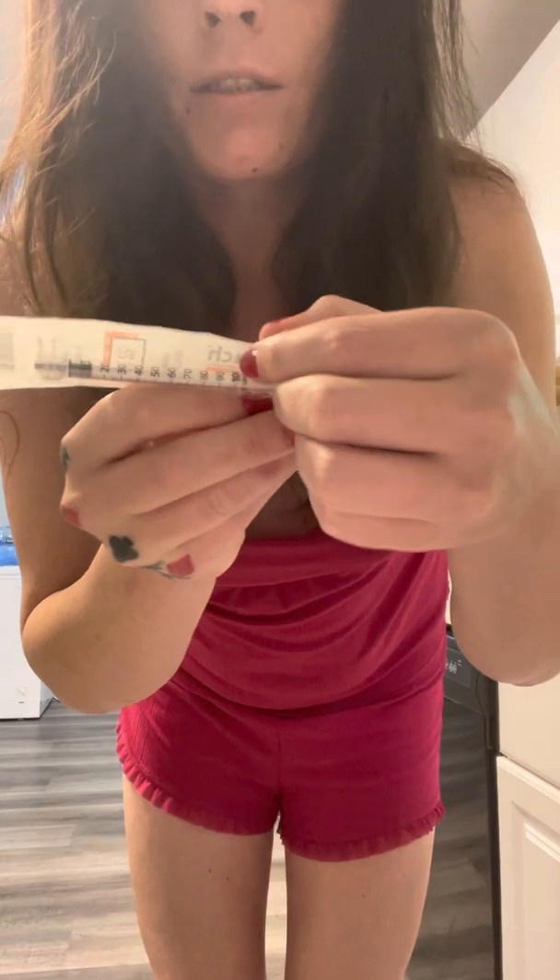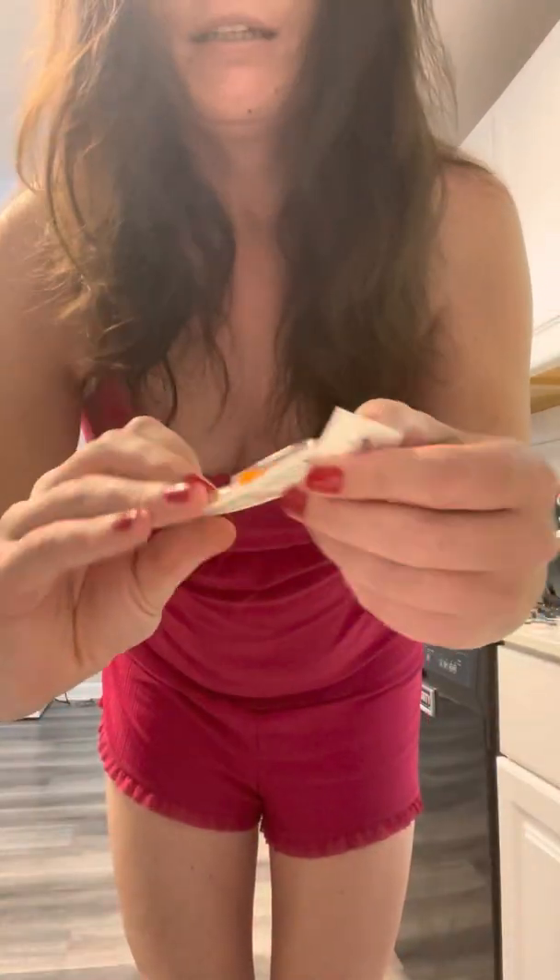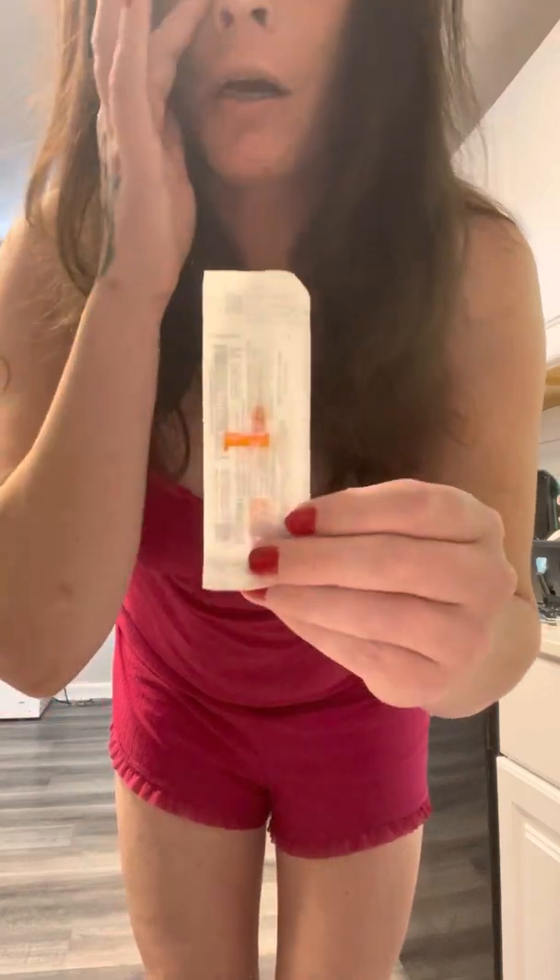One of the things that I'll be using is what's called estradiol valerate — it's a little vial. I'll be using a larger gauge needle to draw the solution from the vial, and I will be using a syringe. These are usually insulin syringes; it's noted as an insulin syringe barrel, but that's what's prescribed. And then a thin, small needle to give myself the injection.